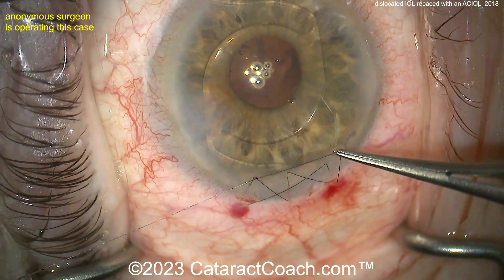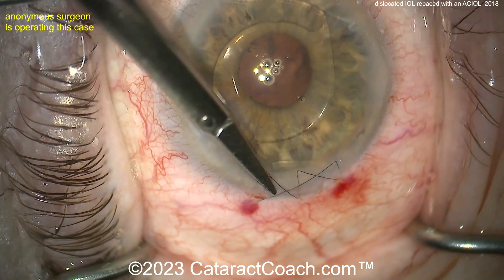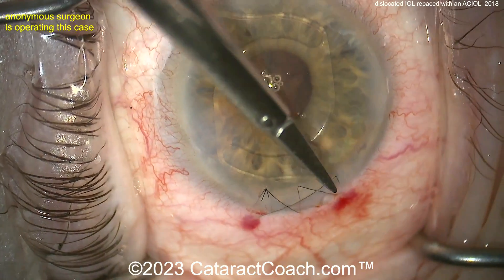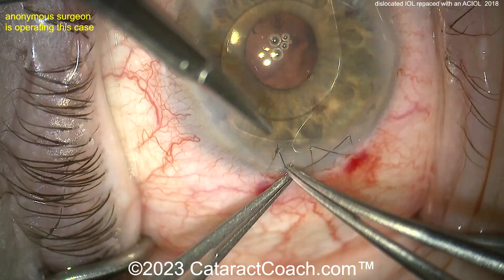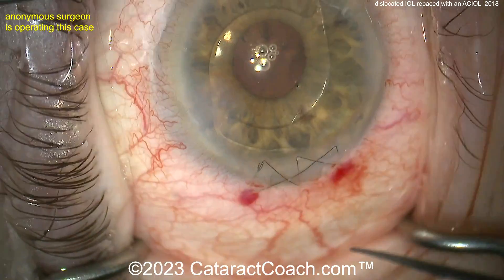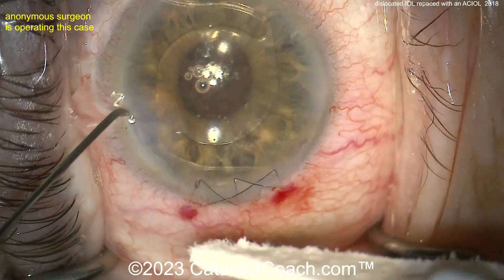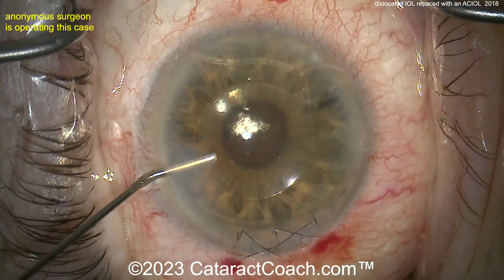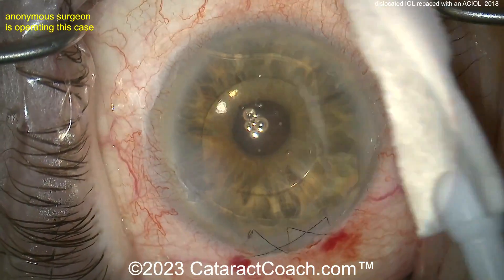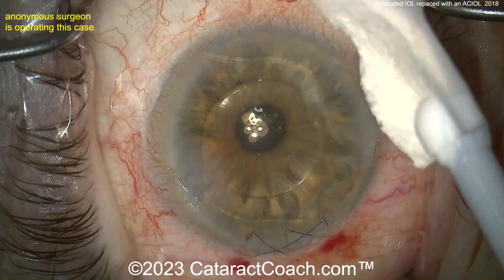Interesting case. There is still a role for AC lenses — if you look at published meta-analyses, patients who get a well-placed anterior chamber lens can actually have the same outcome as a patient who gets a scleral-fixated posterior chamber lens. Around the world there are other options, but not in the US — we don't have iris clip lenses for aphakia. If you're using an AC lens, do it right: make a good incision, place it appropriately so it's well centered and not distorting the iris or pupil, and remember to put the peripheral iridotomy in. The outcome looks pretty good.